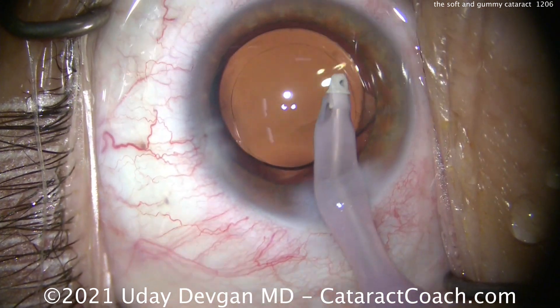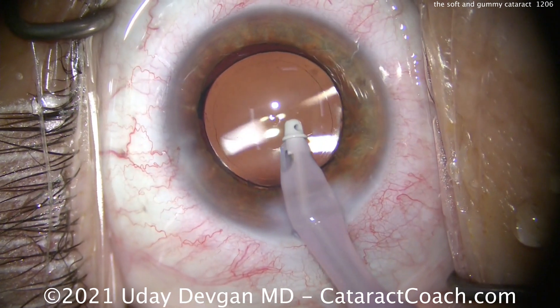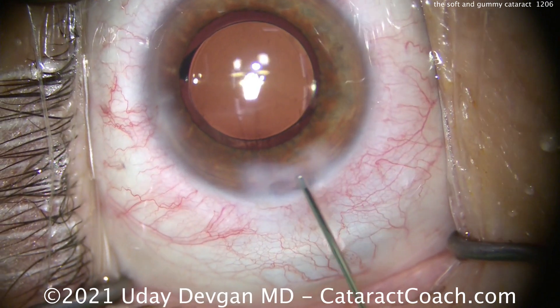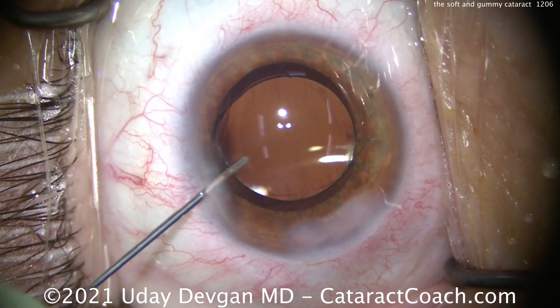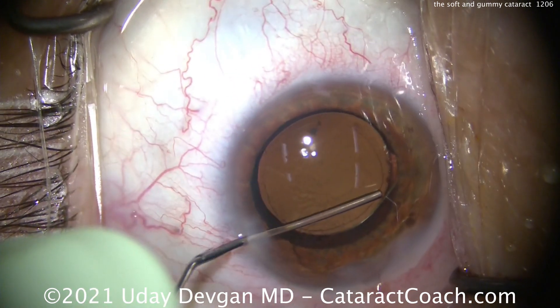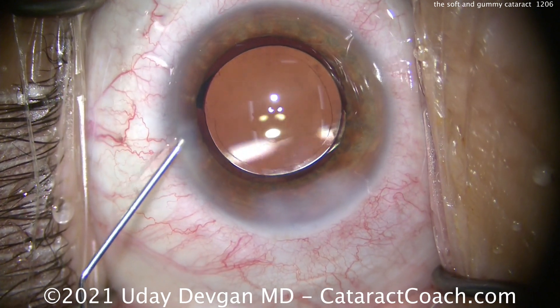You're going to have cases like this where the cataract is a little bit gummy. The patient you'll see this in is not super young — not 30 or 40 years old with a PSC — but rather a patient who's mid-50s, maybe even 60 years old, who has not much PSC but has opacities or flecks in the central nucleus and doesn't have a whole lot of nuclear sclerosis. When you see brunescent or browning, or real nuclear opalescence of the central nucleus, that's going to be more density and easier to chop. But a case like this without that will end up being a little gummy. You've just got to take your time, do it right, and be cautious about getting that lens up out of the bag.